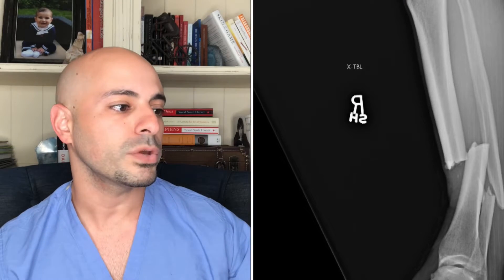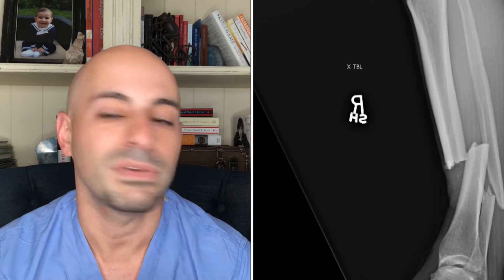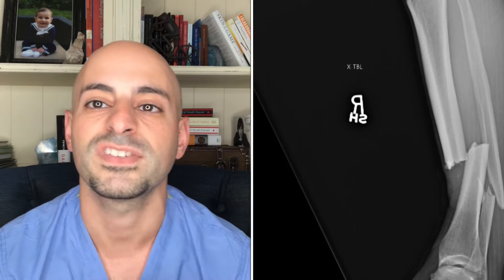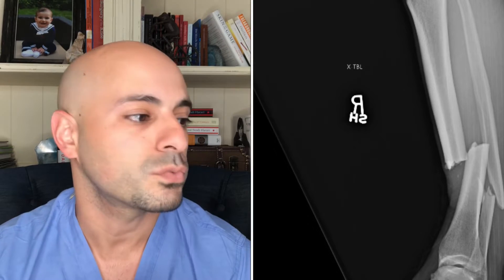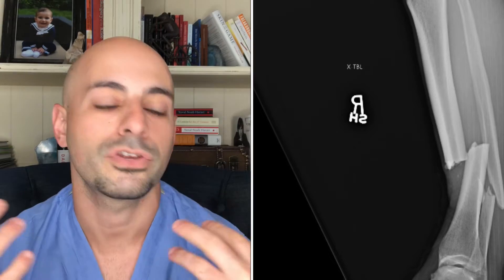Let's start by looking at his pre-injury x-ray and go from there. He showed one x-ray of his pre-injury films — the x-rays taken before he had surgery. We would call this a lateral view, or a view from the side of the leg. As orthopedic surgeons, we would describe this as a displaced fracture with shortening.